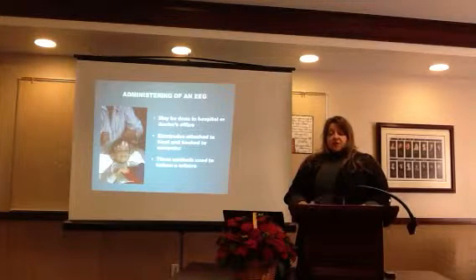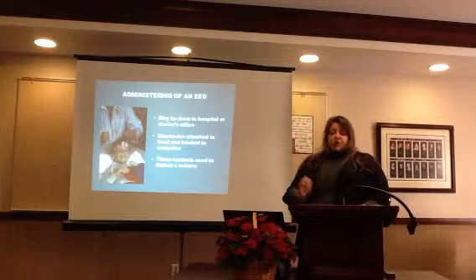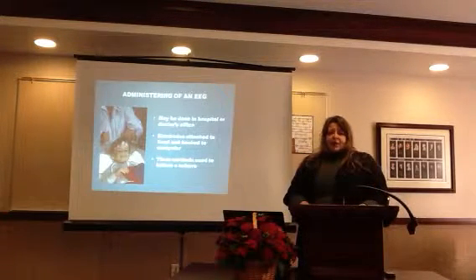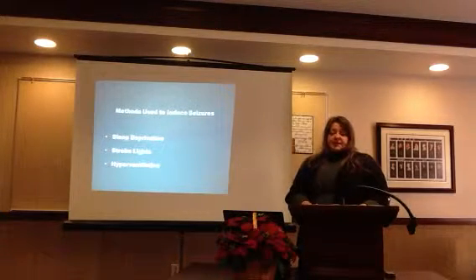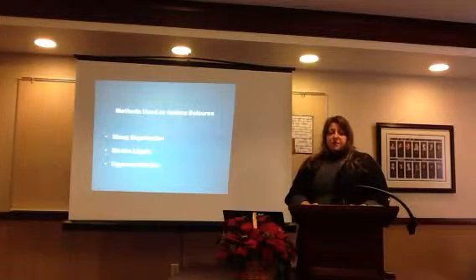When the technologist starts the EEG, the recording will show up on the computer screen where the technologist can monitor it during the test. As a side note, there's virtually no pain or discomfort involved in an EEG. During the test, there are three methods that the technologist will use to induce seizures. These are used by the neurologist as he reviews the EEG to analyze.